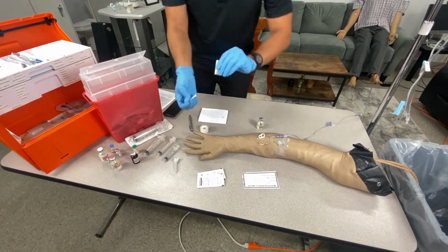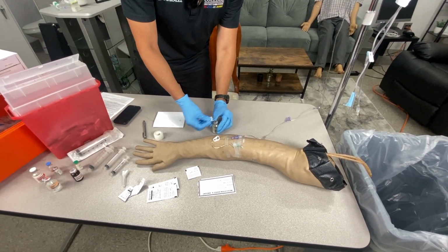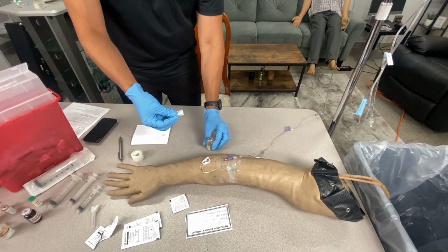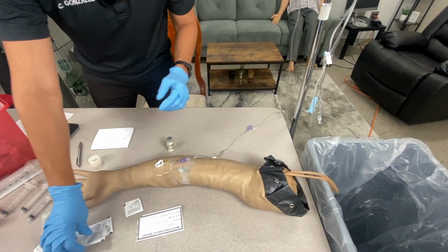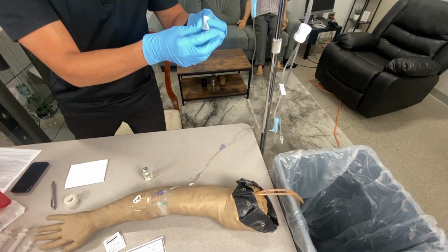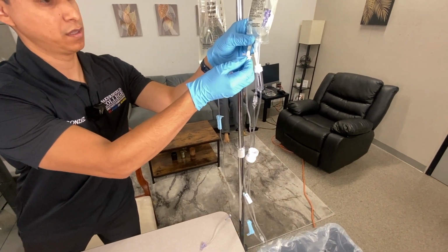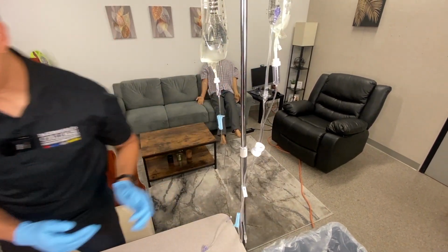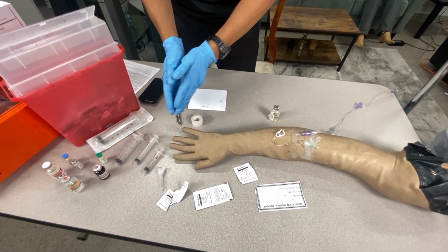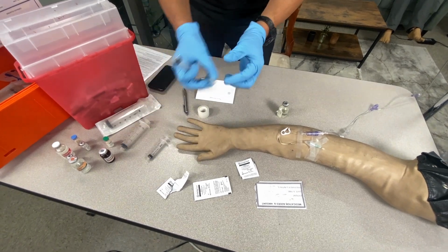Forgot to grab these. But I'm going to cleanse the ports on my medication using aseptic technique. Throw that in the trash. I'm going to also cleanse the port on my medication bag, which is going to be 250 mLs of normal saline. All right, I'm going to make sure that I pick the correct syringe, which is going to be the 10 ml syringe.